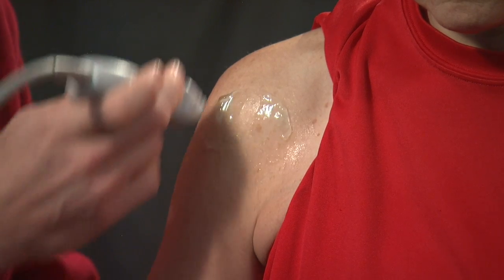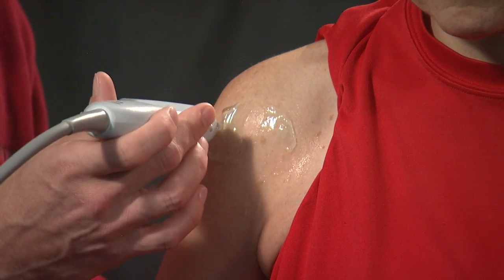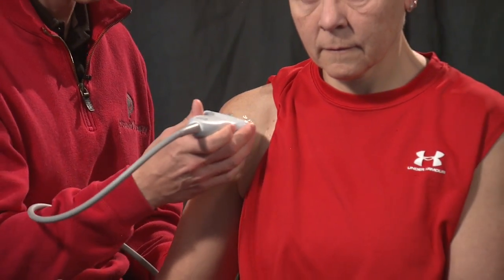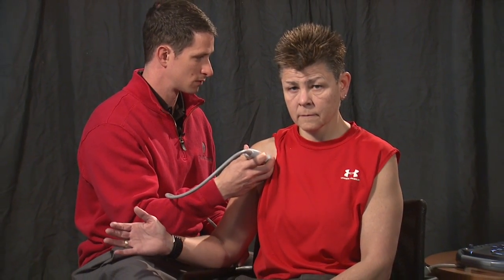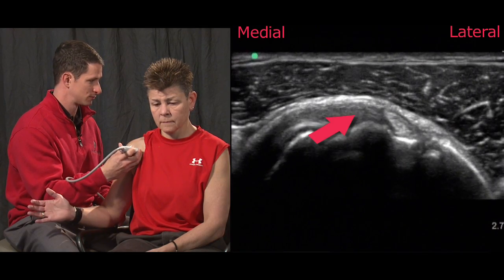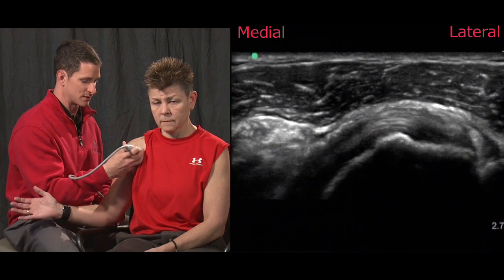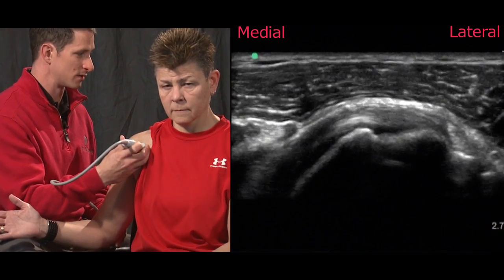Due to the proximity of the biceps to the subscapularis tendon, next we'll move medially towards the patient's midline and ask the patient to slowly externally rotate their arm. Here we can see the subscapularis tendon in the long axis, and as we slide superiorly and inferiorly we can scan the entirety of the tendon.